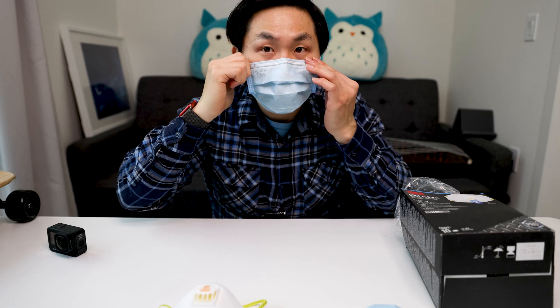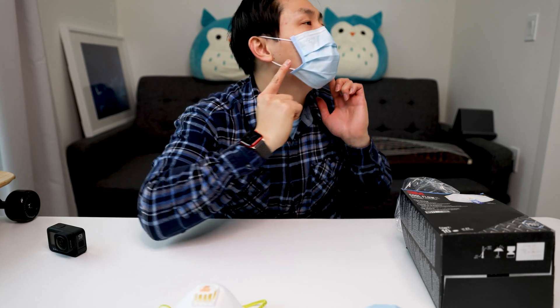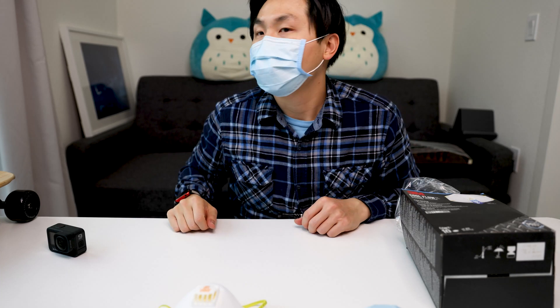Always check — if you have a mirror, check the nose, check the side, and the bottom part, left and right.